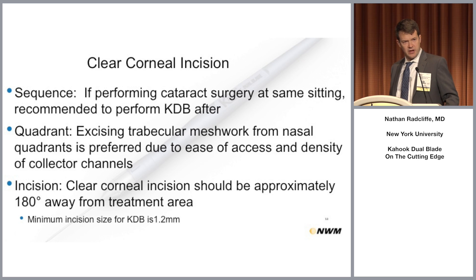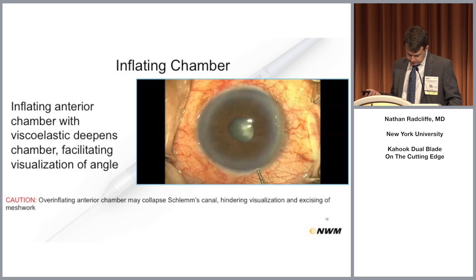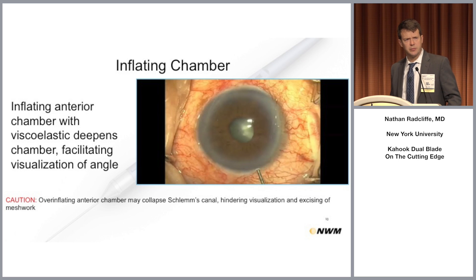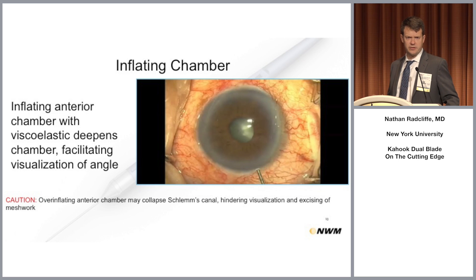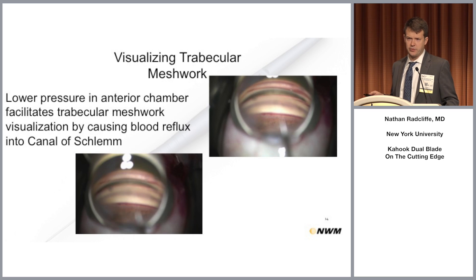We're generally going for the nasal angle because we have a temporal incision. It's not impossible from a superior incision, and we want to get as much of the angle as possible. We want the chamber to be deep — more of a challenge in a phakic eye. In pseudophakes after cataract surgery and IOL placement, just touch up the anterior chamber with a little more cohesive viscoelastic and then do the procedure. Make sure you've got a good angle and visualization before introducing the instrument.